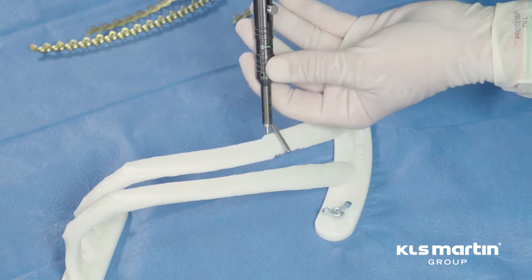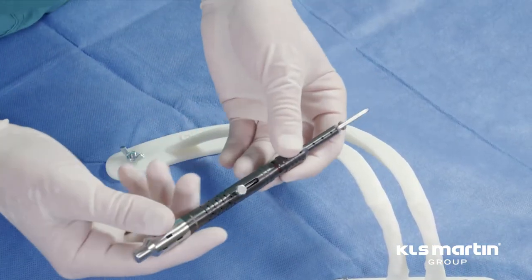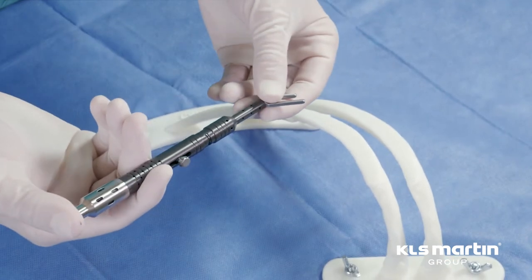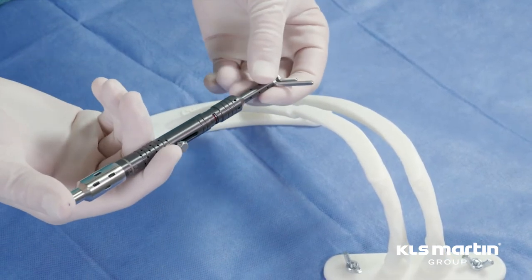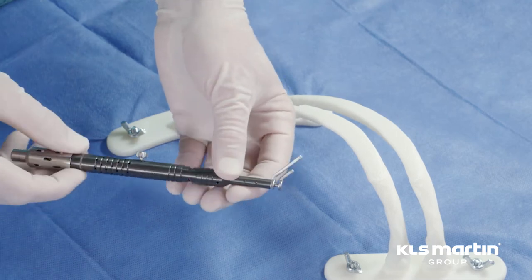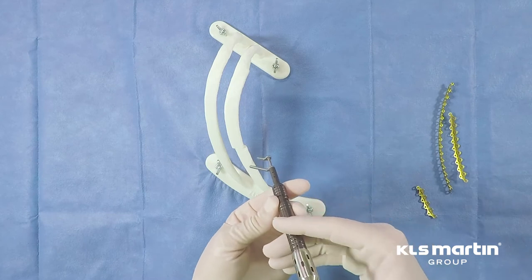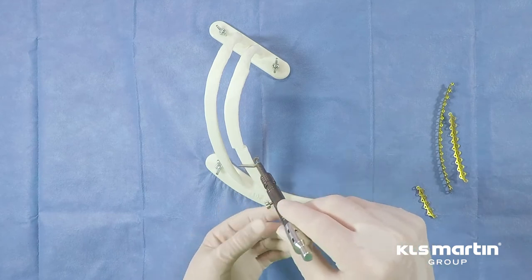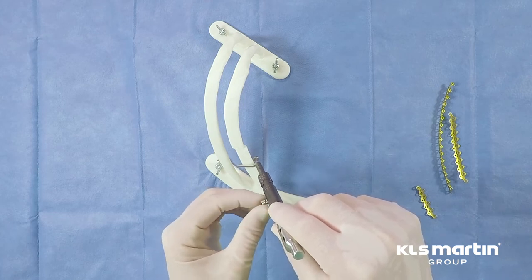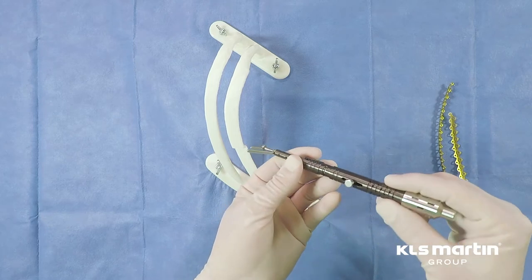It's extremely unusual to have a rib so thin that this system is not usable. Small adults — frail elderly ladies in their anterior ribs — may, in fact, be too thin, but that's the only scenario I've encountered where the rib is too thin to use the 7-millimeter screws. One may lock the caliper into its measured position, allowing you to extract it from the wound to check the indicator.